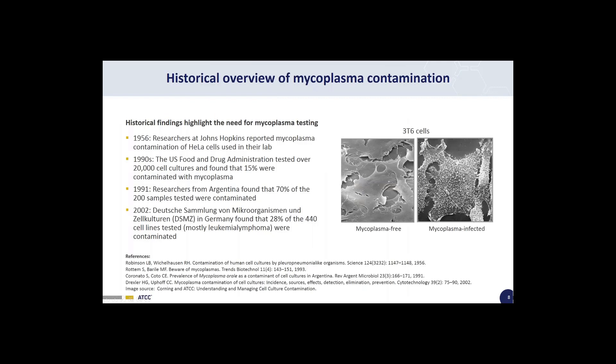I will now give a historical overview of mycoplasma contamination, highlighting findings that emphasize the need for mycoplasma testing. In 1956, researchers from Johns Hopkins reported mycoplasma contamination of HeLa cells. By the early 1990s, the US FDA had tested over 20,000 cultures and found 15% contaminated with mycoplasma. A study in 1991 from Argentina found 78% of 200 samples tested were mycoplasma contaminated. More recently, in 2002, a report by DSMZ in Germany found 28% of 440 lines tested were contaminated. Hence, mycoplasma contamination in cell culture is a long-standing and persistent problem.